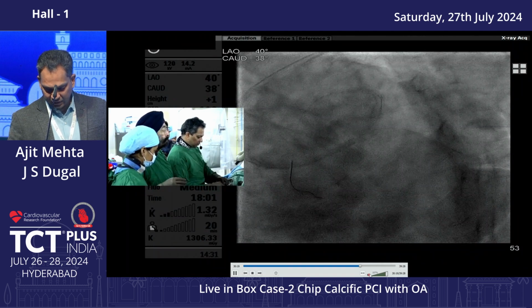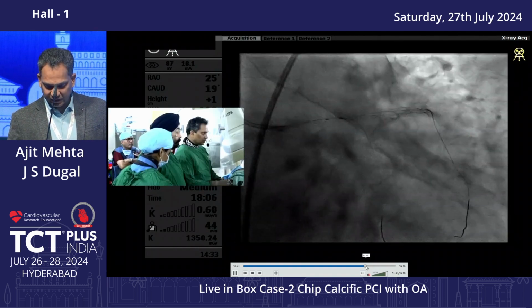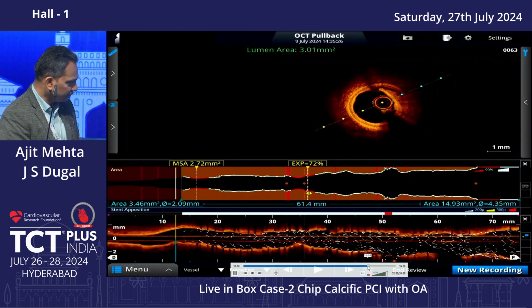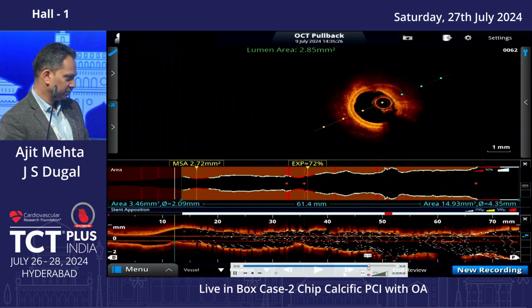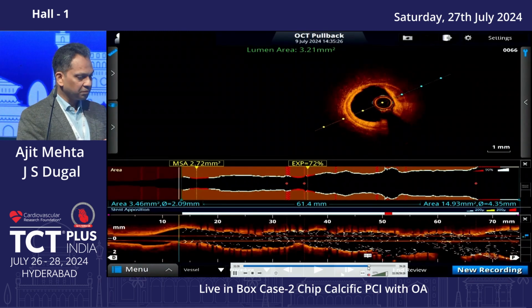And I think I need to finish it off. Yeah, we need to quickly wrap up. I think one advantage of doing it sequentially, or not doing it simultaneously, is if you inflate from the left main into the circ, just the DCB, you'll still have flow down the LAD because of the sizing. And so you can probably keep it up for the full minute if needed. So that's just one thing.